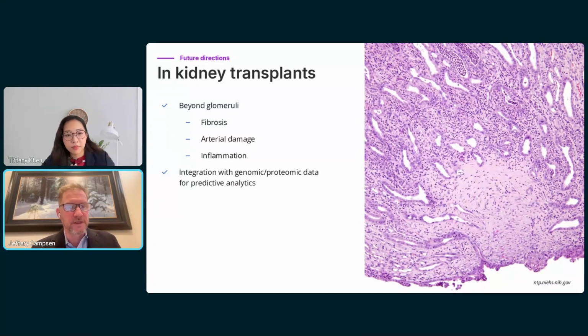Many of these donors have gone through quite the ordeal to get to donation, and inflammation is very important to understand. And then there's cutting edge technology on different types of genomics and DNA and things like that. And as slide preparations change, we can adapt our model to also potentially program into these new changes.